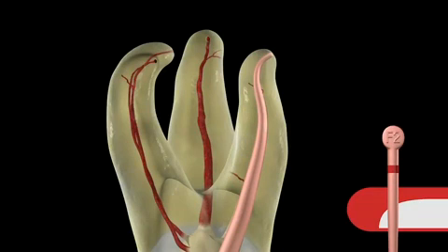Well-shaped canals can be three-dimensionally cleaned, and root canal systems that are clean can be filled in all their dimensions. A well-shaped canal is easy to fit a cone into. A medium non-standardized gutta-percha master cone will easily slide to length. You could also use a size verifier if you were using a gutta-core obturation method. Either a vertical condensation method or a gutta-core obturation method is the method of choice if we want to fill root canal systems.